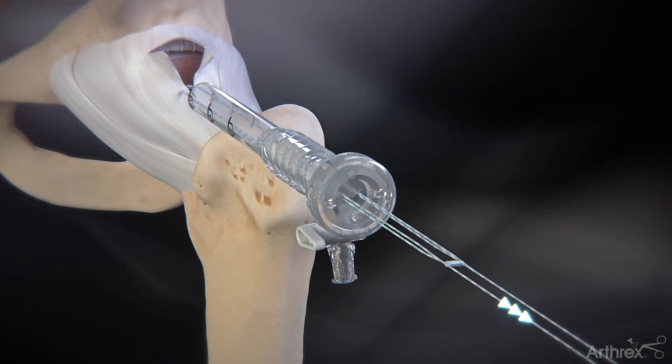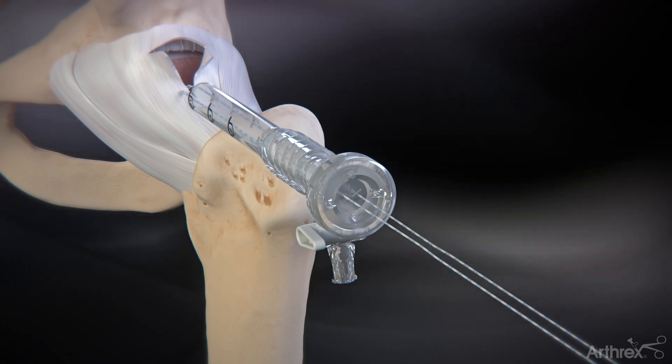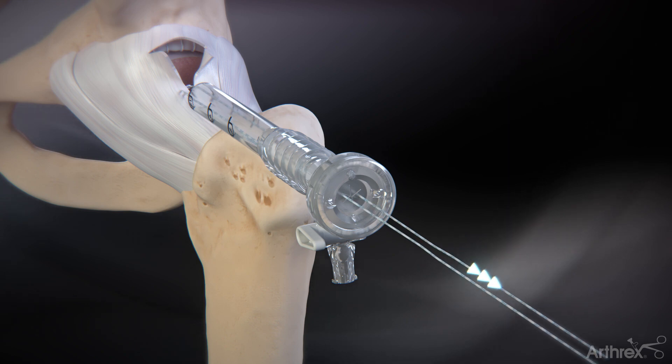Pull on each of the tensioning strands, alternating approximately two centimeters on each side, until the suture splice seats on the two limbs of capsular tissue. To improve suture management, fiber wire suture scissors may be used to cut and shorten the length of the suture strands prior to the final tensioning.